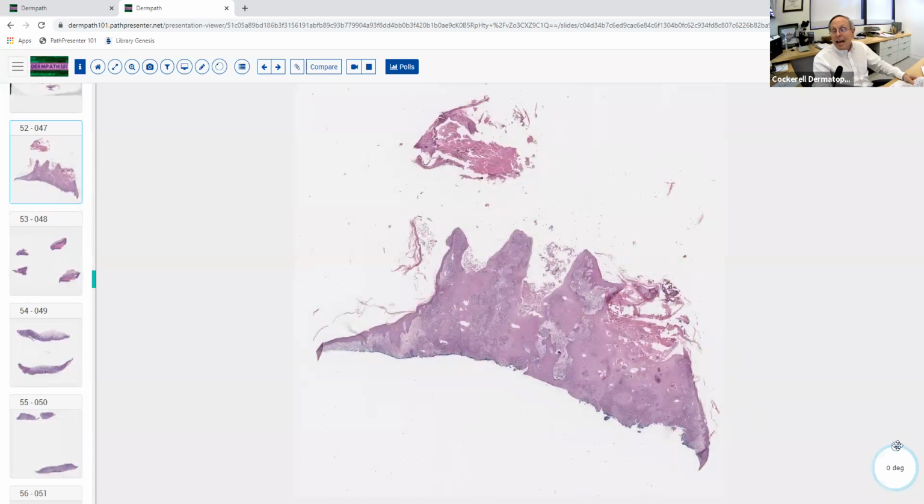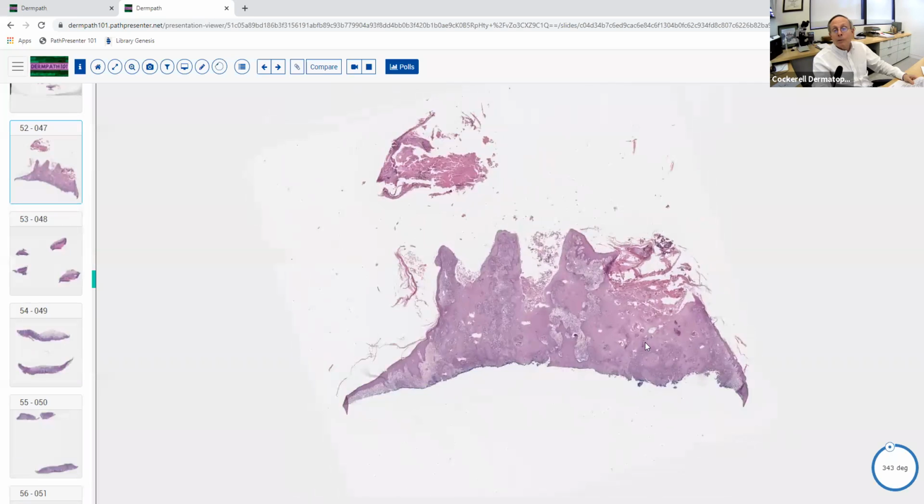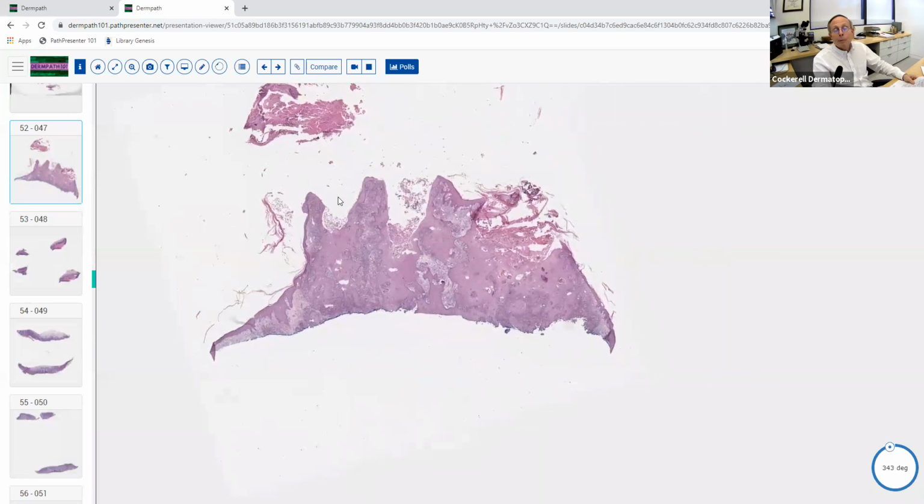Okay. Now what do we have? Okay, we've got a shave biopsy. We see a marked verrucous epithelial hyperplasia, and at low magnification, we see some inflammation in the dermis. And notice that it's got somewhat of an exoendophytic architecture to it, but it's not really cup-shaped, with a true deep cystic type morphology like you see with the keratoacanthoma.